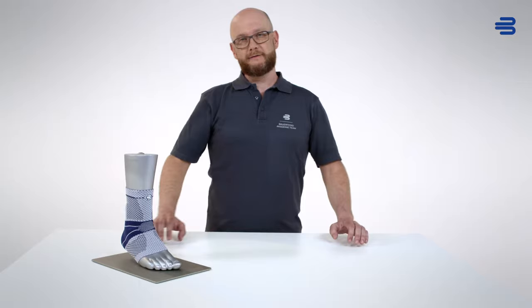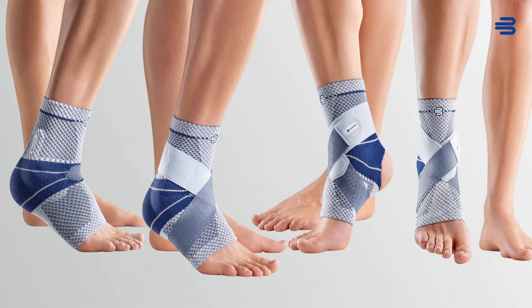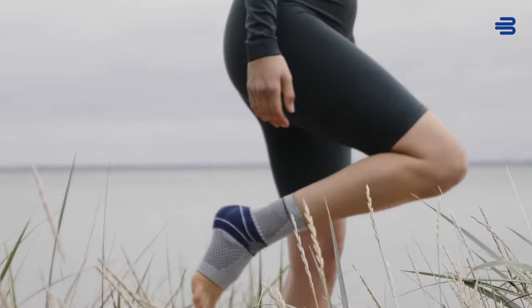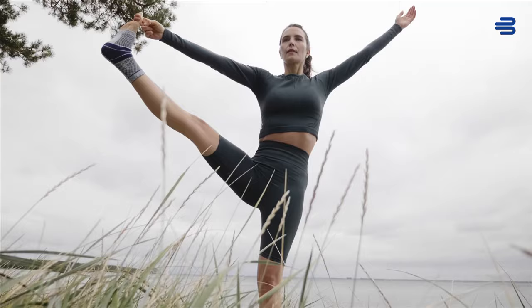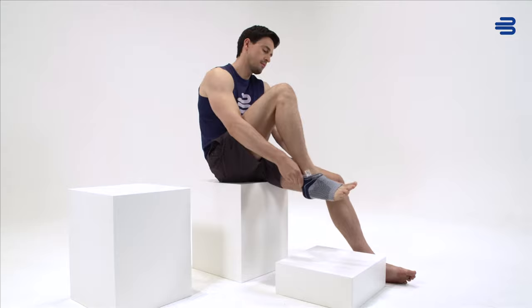You can choose from several ankle supports from Bauerfeind's Malleotrain product range, depending on how much stabilization is required. The Malleotrain is a support for functional ankle treatment. It is suitable, for example, for treating acute trauma and degenerative conditions as well as for preventing repeat injuries.